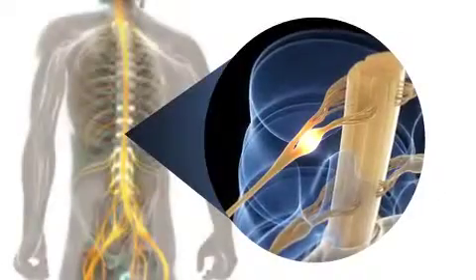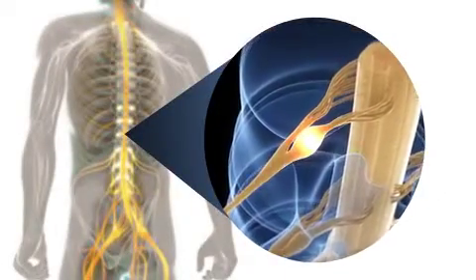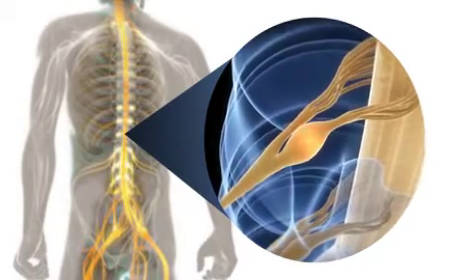Most commonly in the US, it's approved for what we call CRPS, which essentially is a nerve damage to a single nerve within the body of the lower limbs. Dorsal root ganglion stimulation is a way of actually stimulating a single nerve to treat that focal pain condition and block the transmission of pain or modulate the way that you're feeling that painful condition.